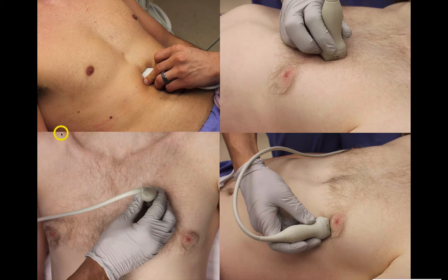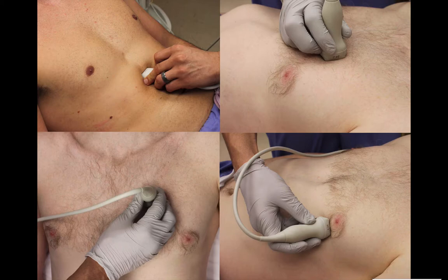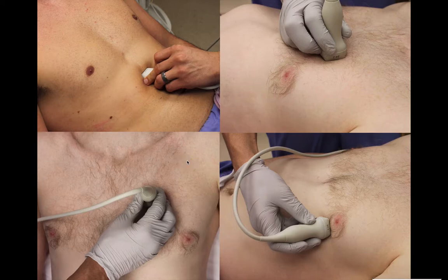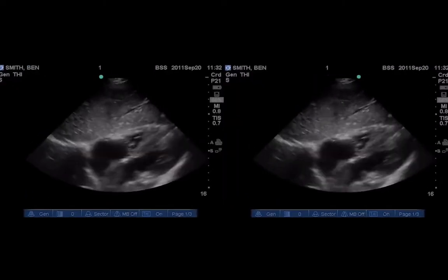Here's how you get those four views: subxiphoid, parasternal long, parasternal short, and the apical four-chamber — which is actually my favorite. I have to pause here and talk about the probe marker. On the apical four-chamber view, that probe marker is facing towards the patient's right. On the parasternal long axis view, the probe marker is facing towards the patient's left hip. The parasternal short is rotated 90 degrees in the other direction. This may vary — everything might be 180 degrees reversed depending on how your machine is set up.